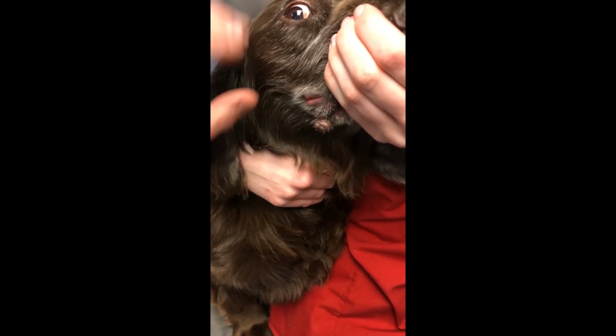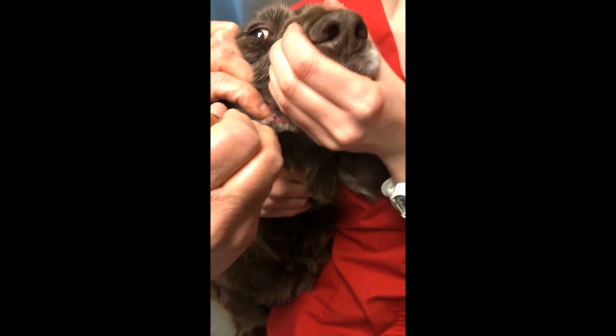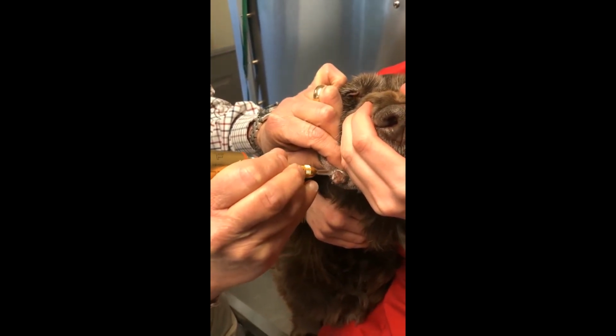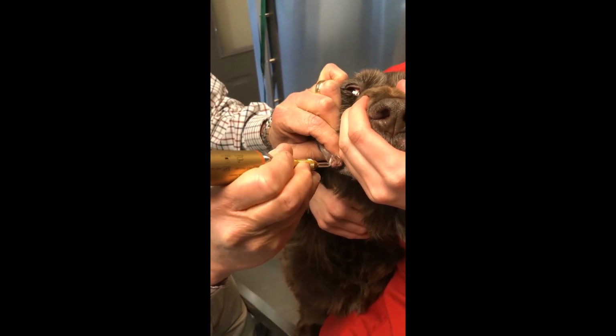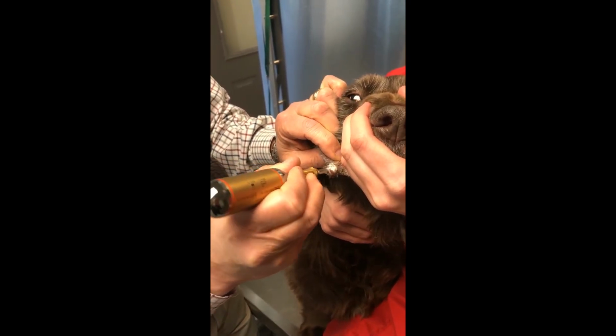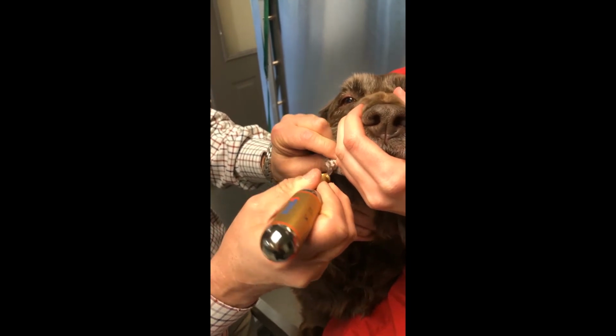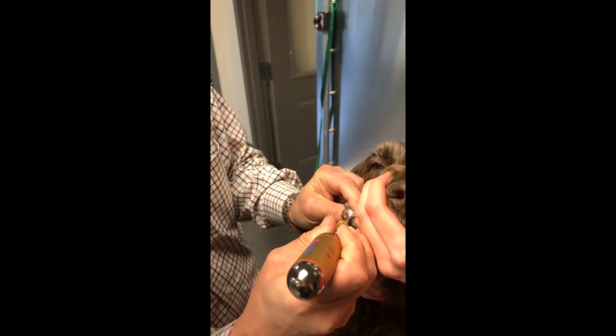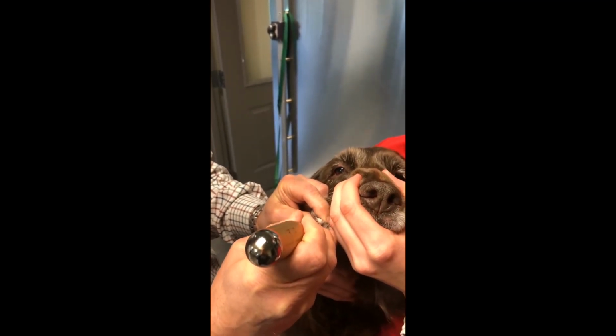So this is the mass post-thaw cycle, and we're going to again start at the base, and we are using the D3 tip, and we're going to freeze this mass in a uniform manner, knocking off the ice crystals as they form.